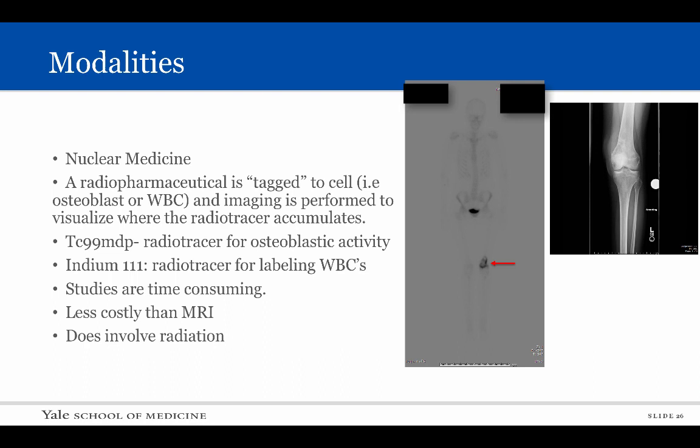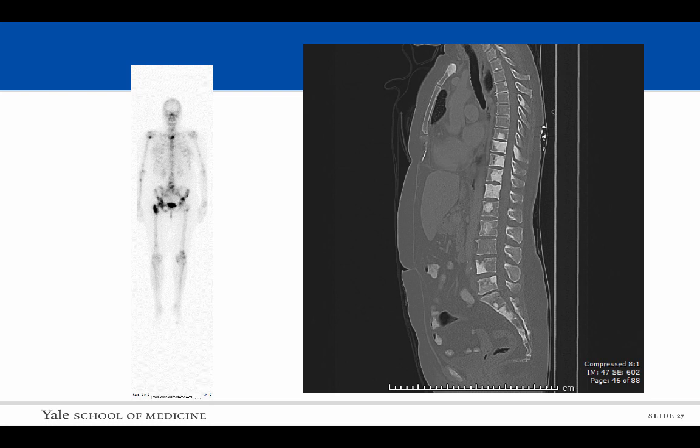You may remember the case of osteosarcoma from earlier. On the corresponding bone scan to the left of the radiograph, there is a focus of increased osteoblastic activity seen as the dark line along the left knee. This bone scan image is from a patient with metastatic breast cancer who shows multiple areas of increased radiotracer uptake which correspond to areas of increased sclerosis on the representative CT image. Osteoblastic activity is ramped up due to the metastatic disease and appears as sclerotic regions on CT.